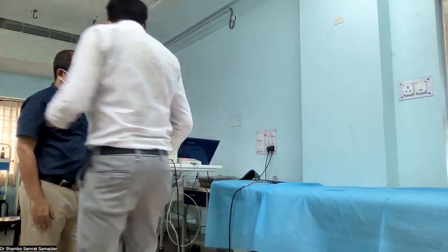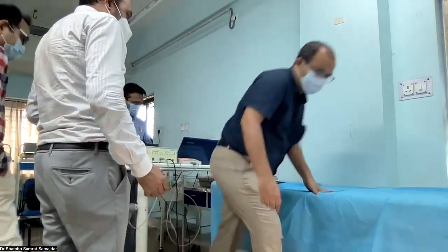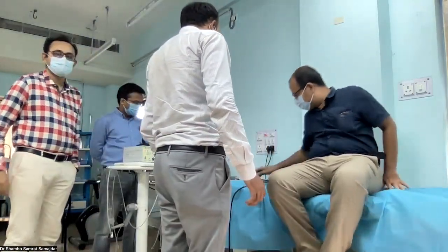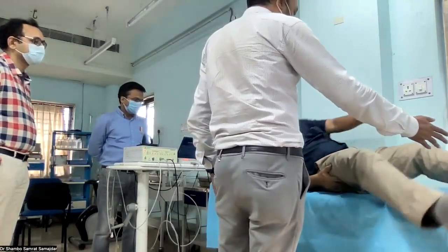Okay, then I will do this over here. And lie down completely in supine position and take off the load.